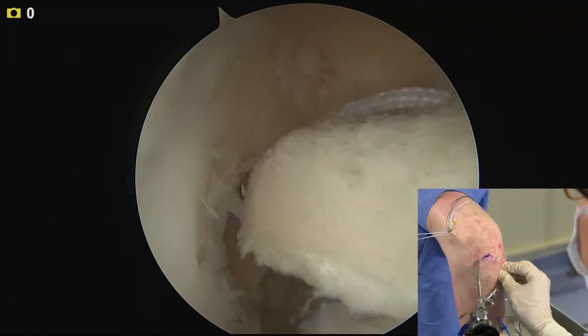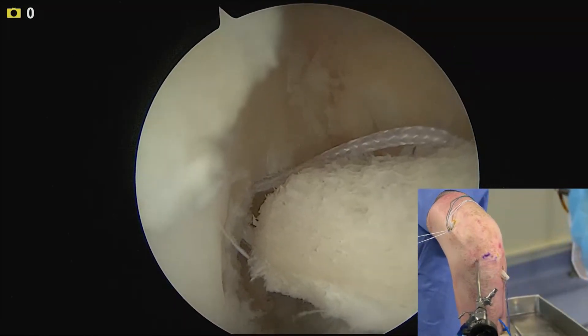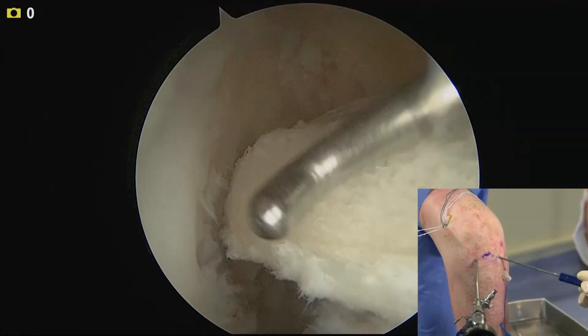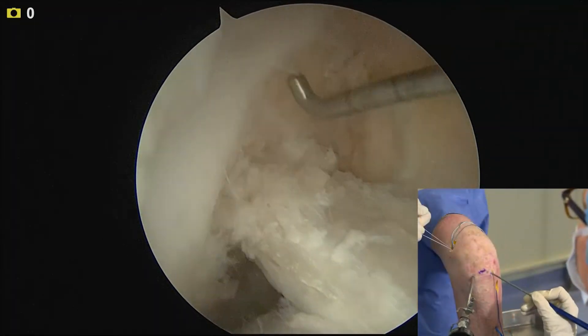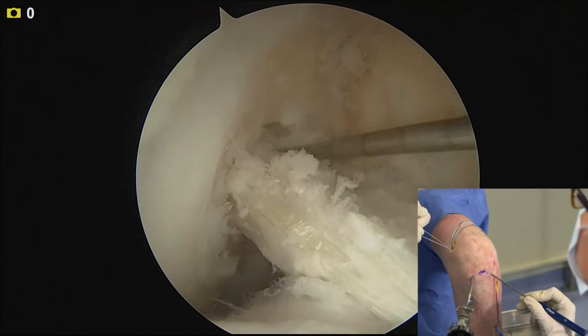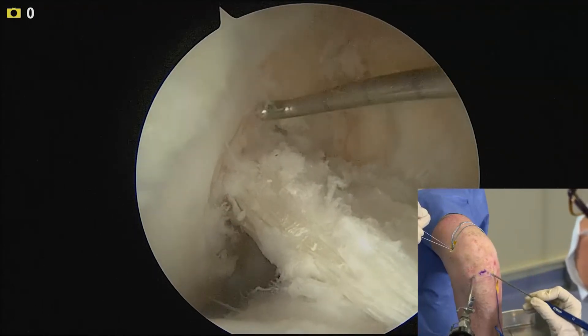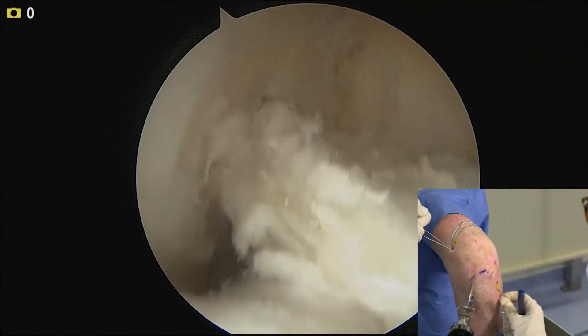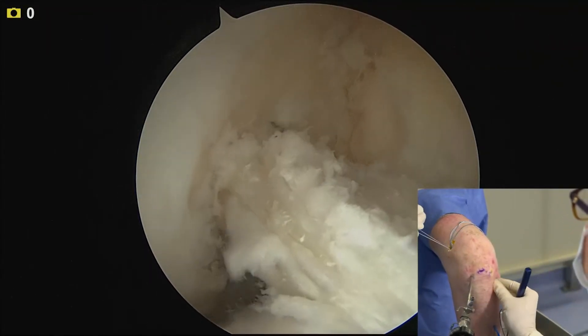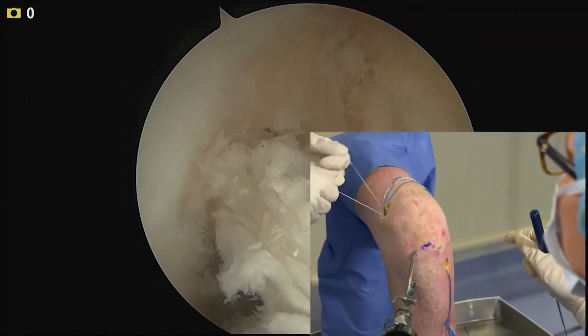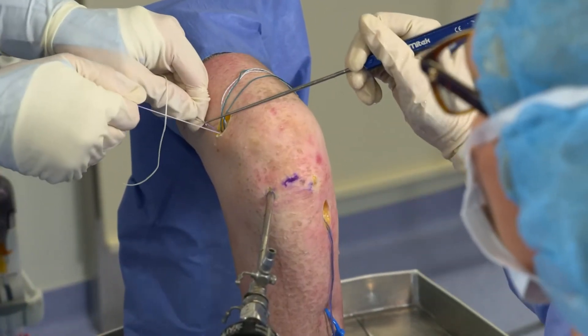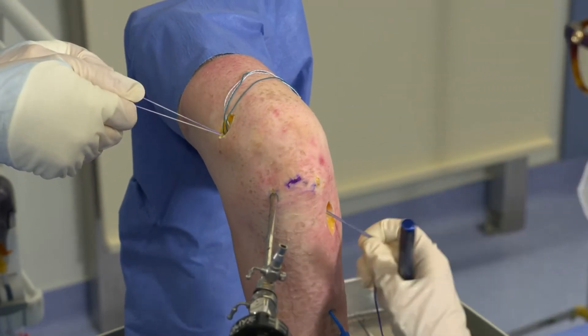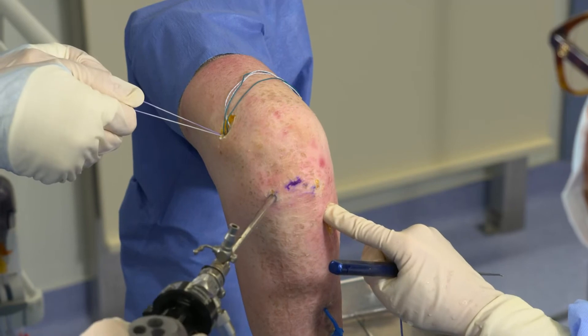I would have my assistant stop here and then I would take a probe and make sure that bone plug starts to get into the tunnel. One key point as the bone plug for the femoral side of the tunnel is being pushed in with the probe, at the same time you should also check your tibial side to make sure the tibial bone plug is going in at the same time and not at an angle. Everything should be in line from the tensioning suture to the bone plug and then the graft as well as down to the tibial bone plug.